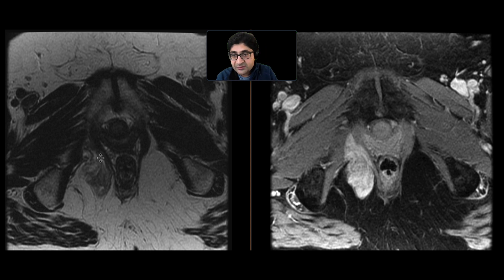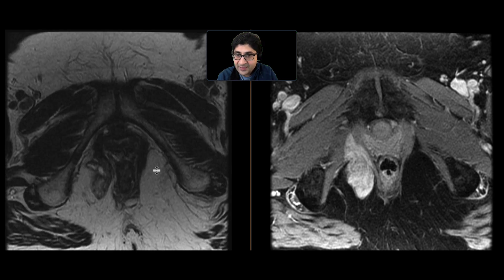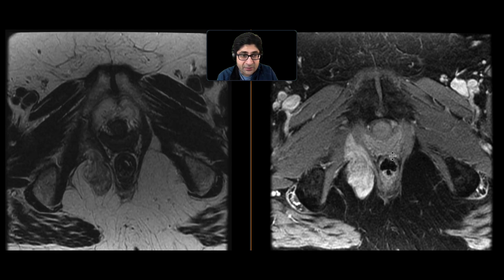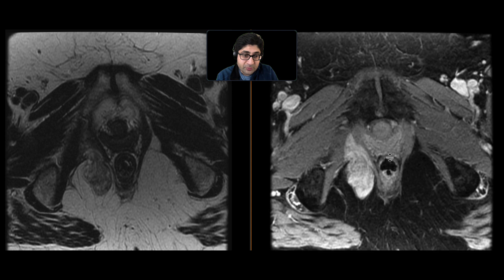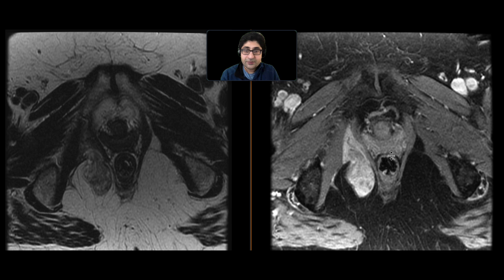It has this sort of appearance on T2 weighted images — a laminated appearance of concentric lines associated with a mass. It can sometimes have a few more discrete cystic components, and it has quite avid enhancement post-contrast. Treatment for this is surgery, but it is often difficult to excise completely and so certainly is at risk for local recurrence.